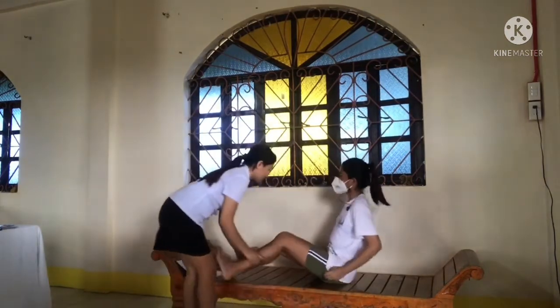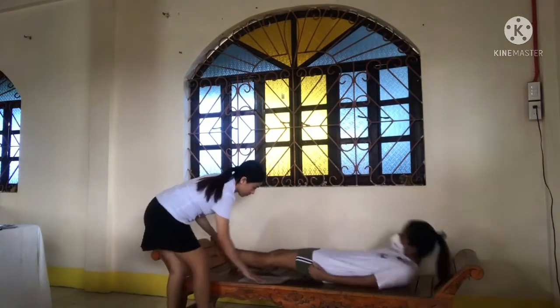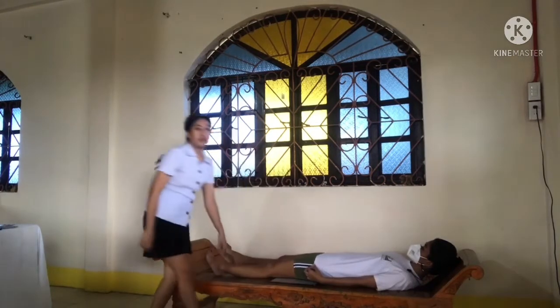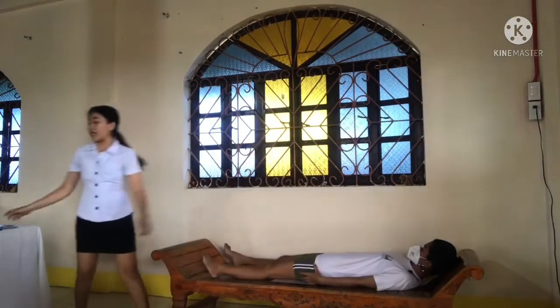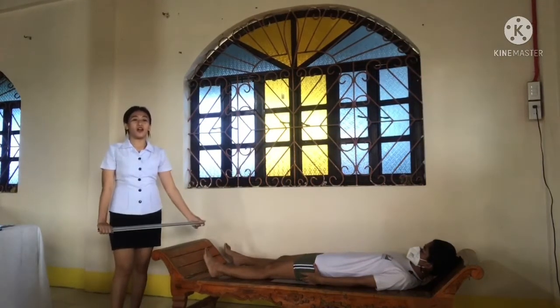must be 18 by 43 centimeters. So place the patient in supine position. So check the pelvis to ensure it is not rotated. Center the IR to the affected side, aligned to the midline of the IR.